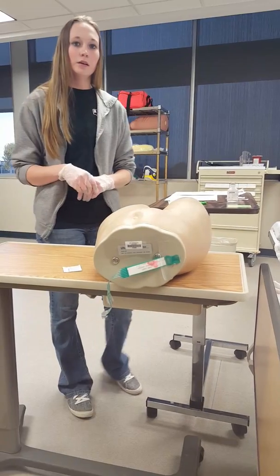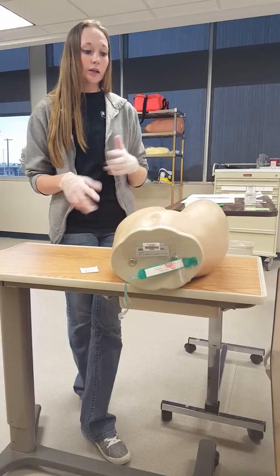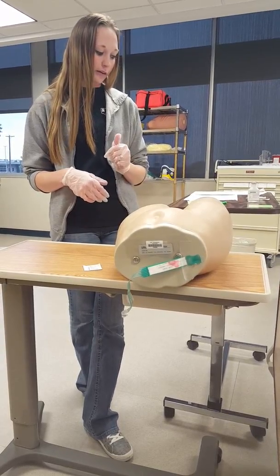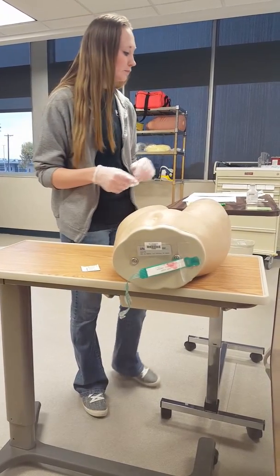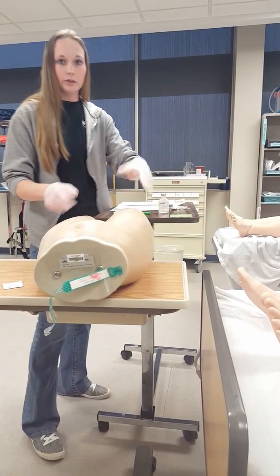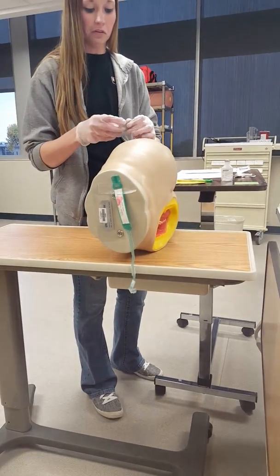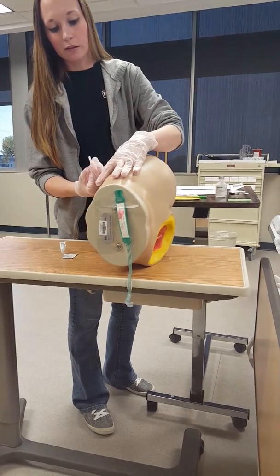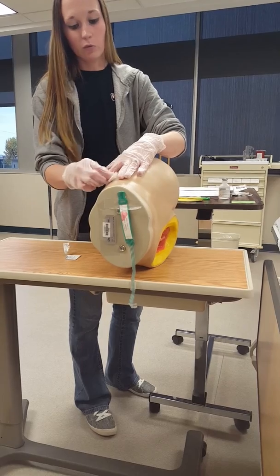Then in the deltoid site, I would give 1 milliliter, and in the vastus lateralis and the ventrogluteal, I would give 3 mLs in those areas. All right, so then I'm going to clean my area, if it'll stay. So I clean it up here. And I would do this for 30 seconds as well.